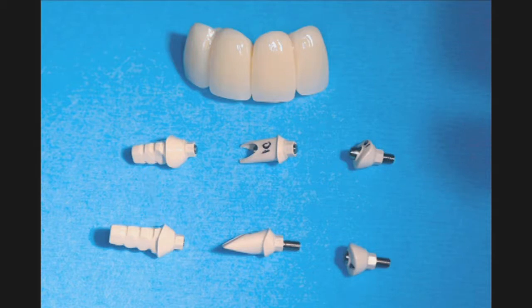The laboratory also pre-surgically fabricated a biotemp bridge, number 7 through 10, from lateral incisor to lateral incisor. All are the approximate ideal tissue contour and emergence profile that were determined using our computer software. This is the next generation in diagnosing, treatment planning, surgical intervention, and prosthetic reconstruction. The laboratory is giving us the final products for transitional restorations prior to any surgical intervention.